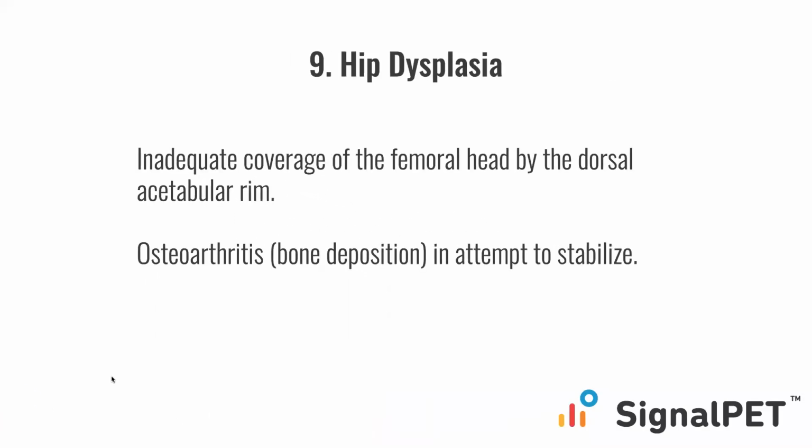Hips are very interesting. When we initially approached hips, number 9, we looked at secondary changes and we more or less assumed dysplasia. However, you can have osteoarthritis, degeneration of the hips, for reasons other than hip dysplasia. So over time, and this is where the system gets better and better, we started separating out dysplasia from just plain osteoarthritis with a lack of dysplasia. So I'll talk about hip dysplasia, which is more common. And interestingly, we see it a lot, but they're not necessarily hip films, because whenever a VD film is taken of the abdomen, unless it's a really large patient, we typically have a nice VD shot of the hips. And so we can make an assessment, specifically the system is able to make a call.